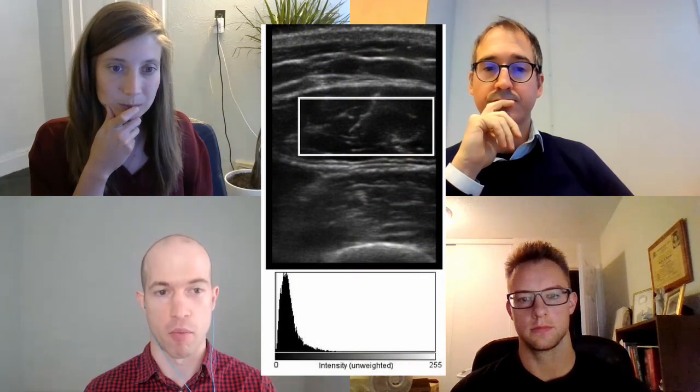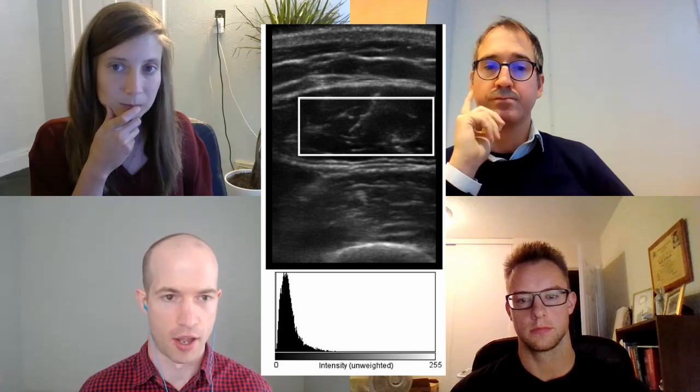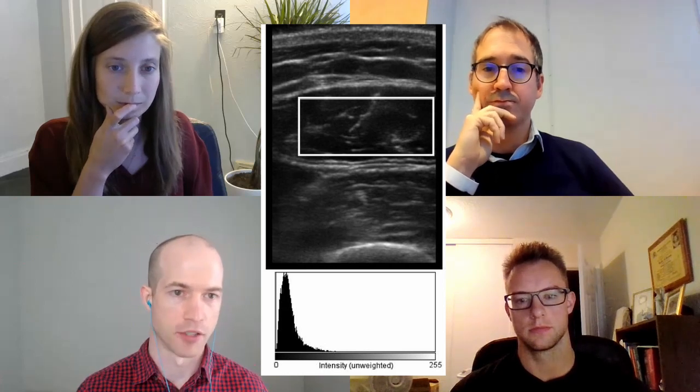When you apply these texture features, one of the ones you will end up calculating will be echo intensity. It's one of the simplest texture features. As long as you are measuring your echo intensity using a nice square box, which a lot of people do rather than outlining the entire cross-sectional area, you would be able to characterize both of these features at the exact same time. So you could examine both of them.